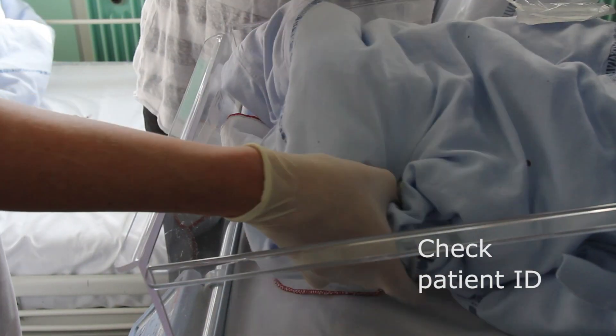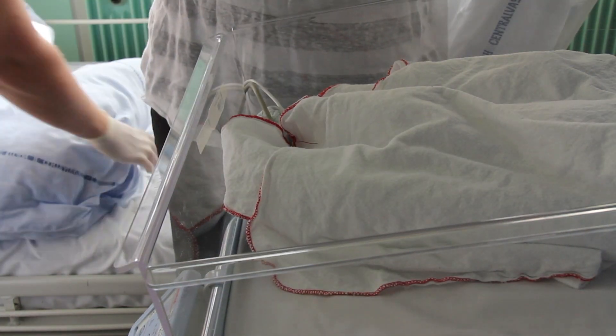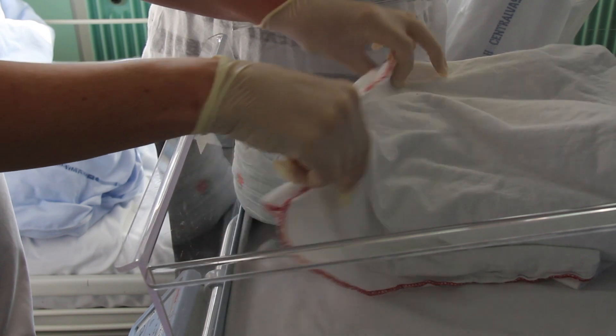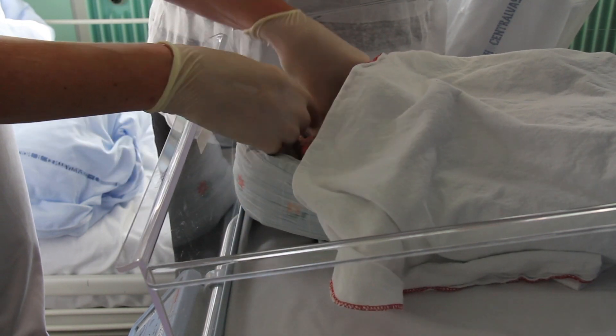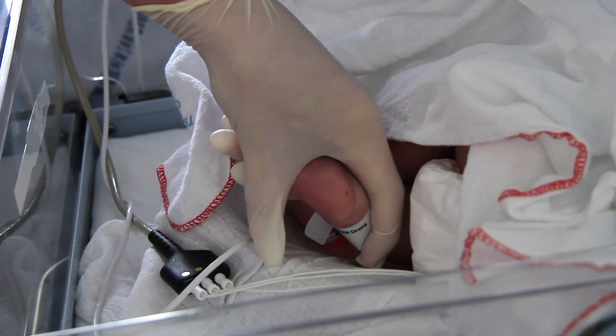Before sampling, confirm the patient's identity. Make sure there is good blood flow to the sampling site. Disinfect the puncture area.